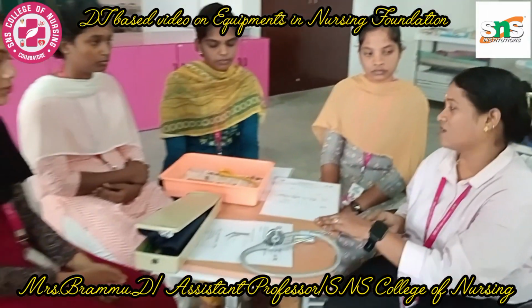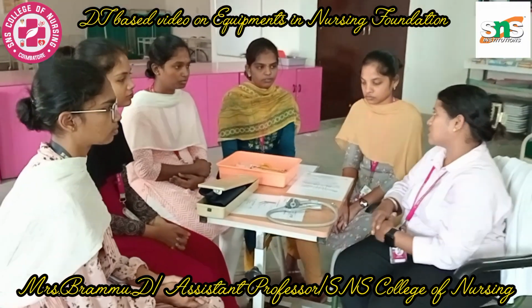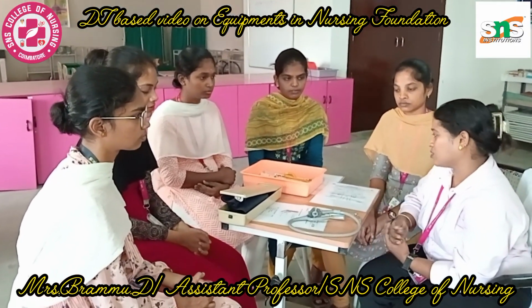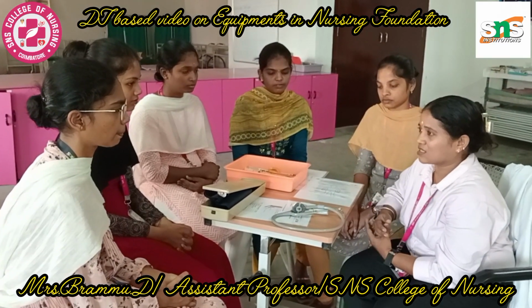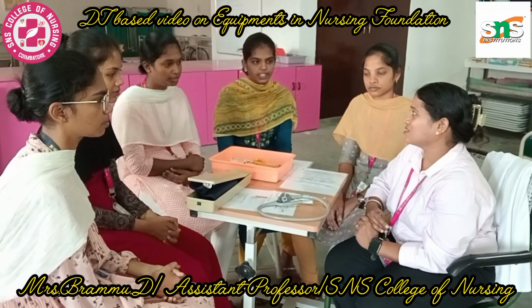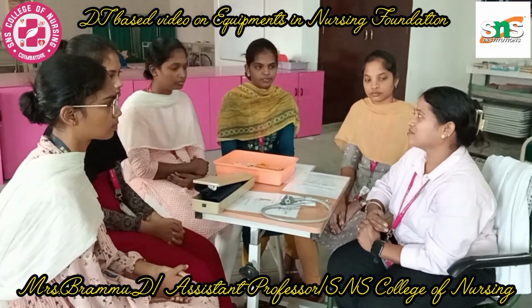So you are clear on the things we discussed today, such as the parts of a stethoscope, parts of a sphygmomanometer, parts of a Foley's catheter, and the sites of pulse. So you are all clear with that? Yes. Any queries?